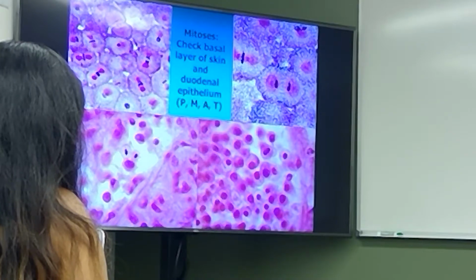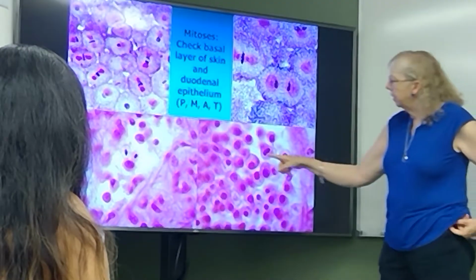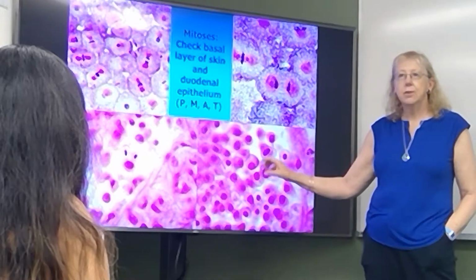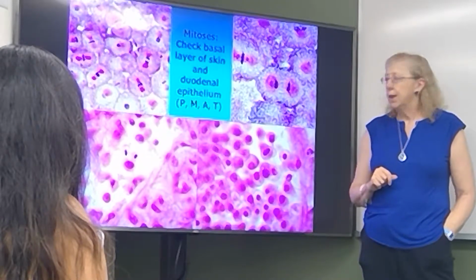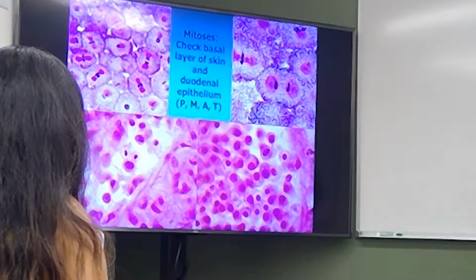If anybody is interested in that, what you can do now, we have equipment that you can take out. It's called laser capture microdissection. So you can look at a slide and pluck out cells from the slide and then extract DNA from them and sequence them. And that's all we need to do here. But I don't know those techniques.